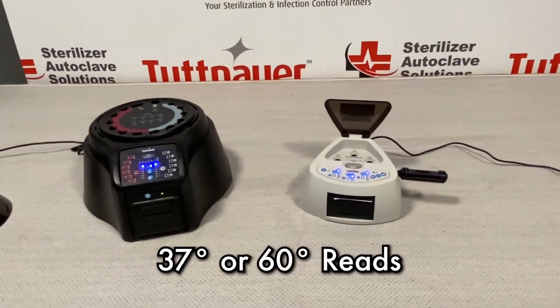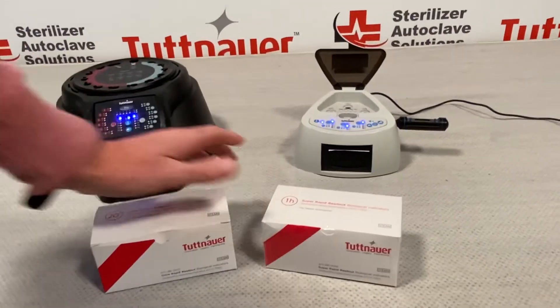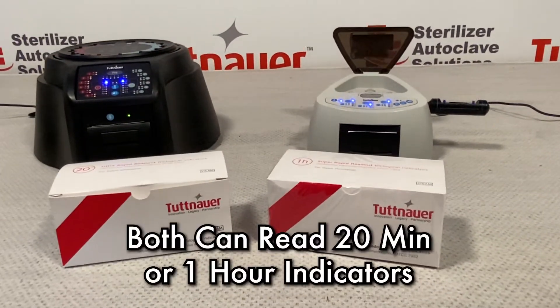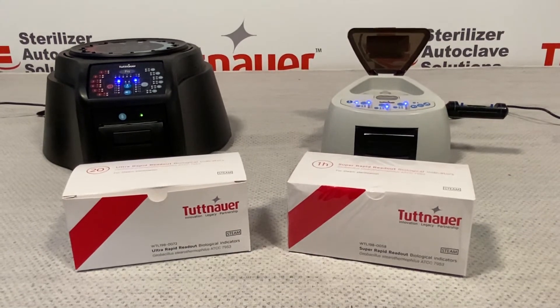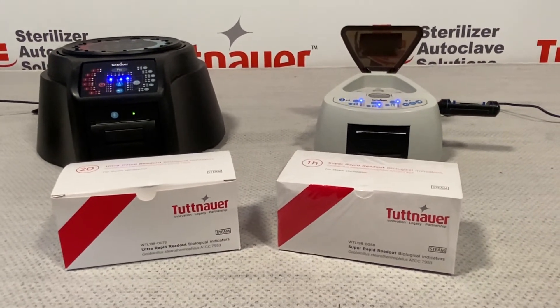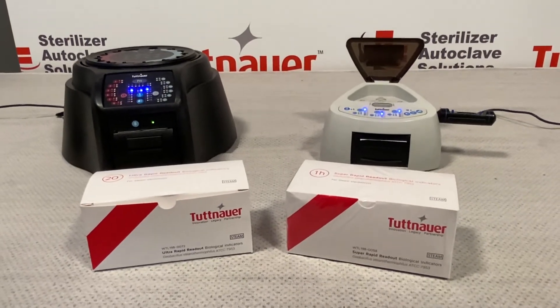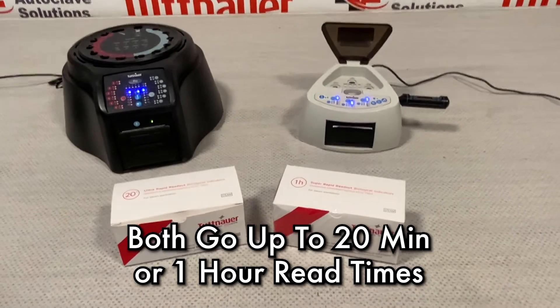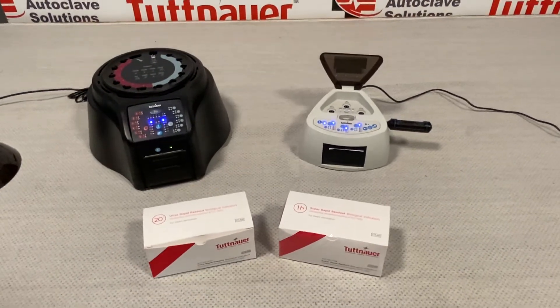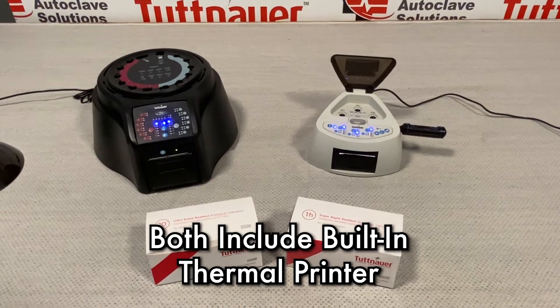Both are available in 37 or 60 degree reads. Both biological readers are capable of reading either a 20-minute or 1-hour indicator available through Tuttnauer. These indicators work with any type of steam sterilization. Each reader can work at 20-minute or 1-hour read times, and when the results are finished, an included thermal printer prints out a receipt of the test results.